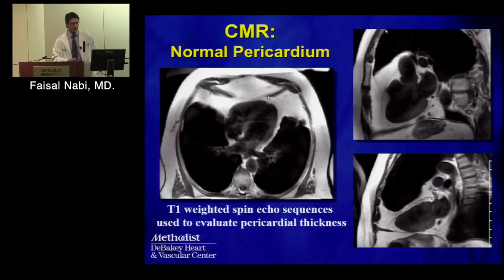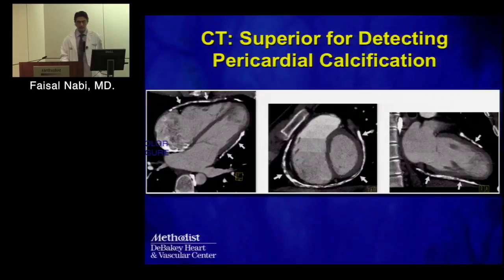Okay, so what about cardiac MRI? So, sir, yes. This is a practical clinical scenario. You have a post-op patient not doing too well. You do an echo. You're not sure about effusion. You're concerned with the hematoma rather than diffuse effusion. Images are lousy.